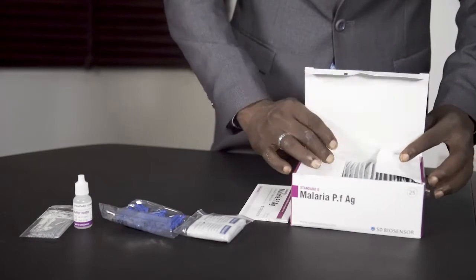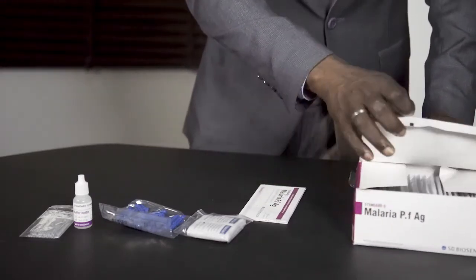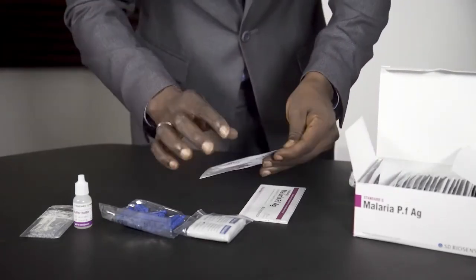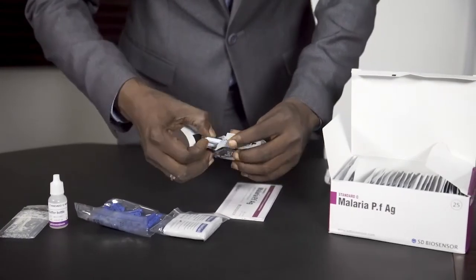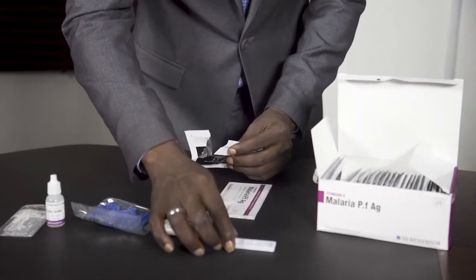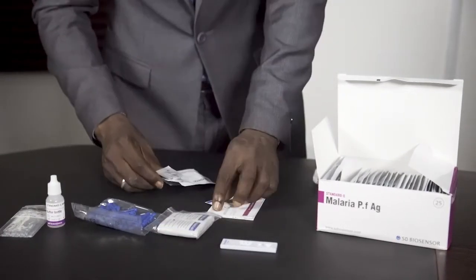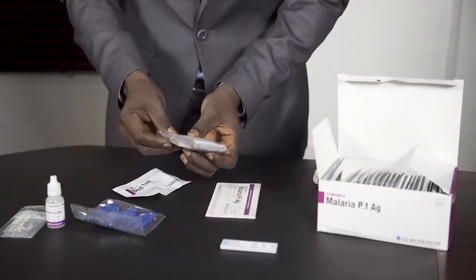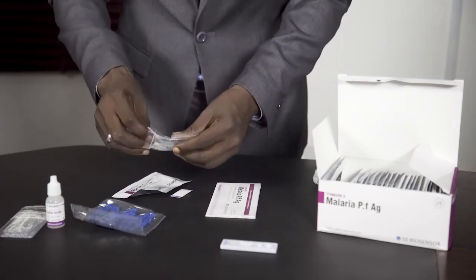Now let me run you through how to use the product. You open it — this is the product, the malaria test kit — and you use the alcohol swab to clean your hand.